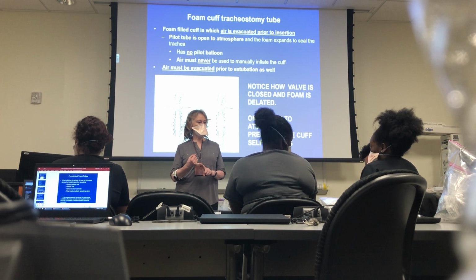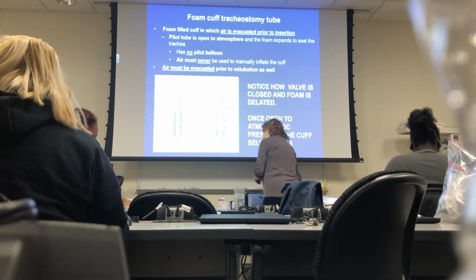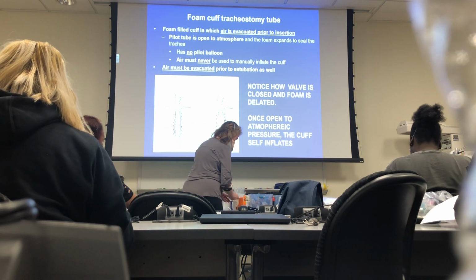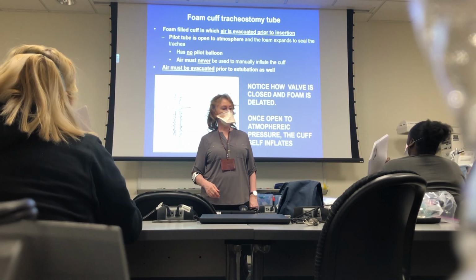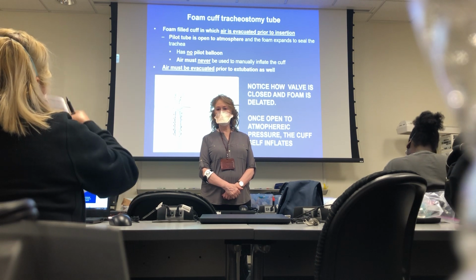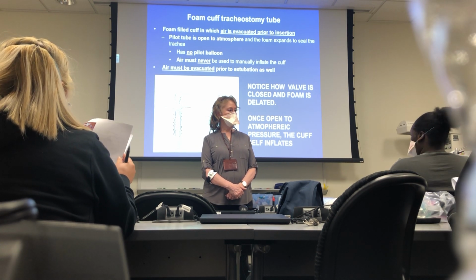Go to your lab books and find the fenestrated trach for me, find the metal trach, and find the foam cuff. Let's see if you guys can find it. Find the metal trach first, and then hold it up. Did you find them? Metal trach? Okay, and the three parts? Great. Find the foam cuff. Find the trach that has a foam cuff. Tracheostomy tube. Is that a tracheostomy tube? Yup.